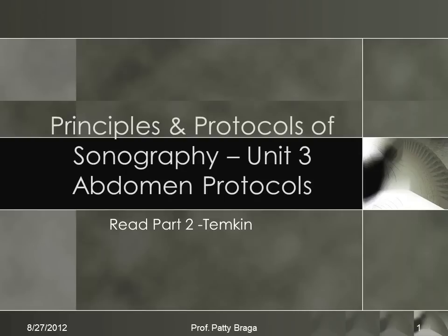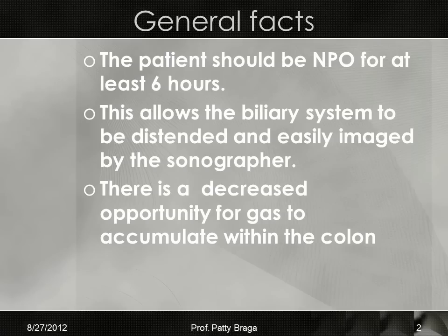Very rarely are you asked to just scan a gallbladder or just scan a liver, though there are exceptions to that rule. Over 90% of the time what you will be doing is scanning either what's called an abdomen complete or an abdomen limited. So the eventual goal is to put them all together so that you can perform those sonographic studies.